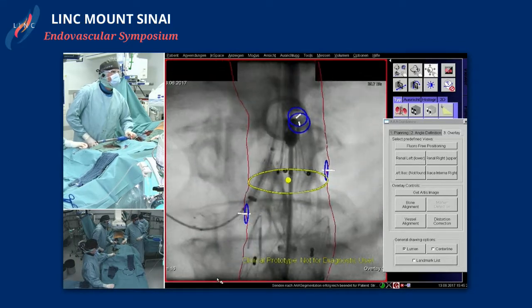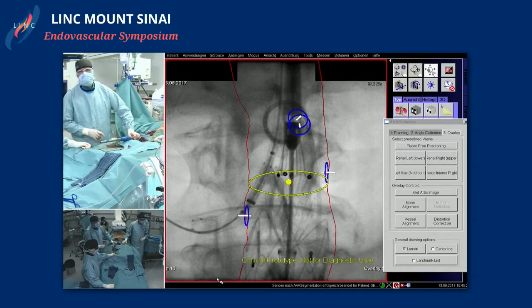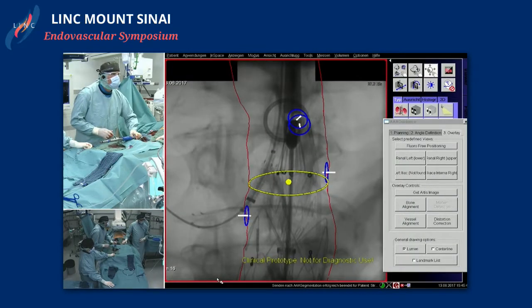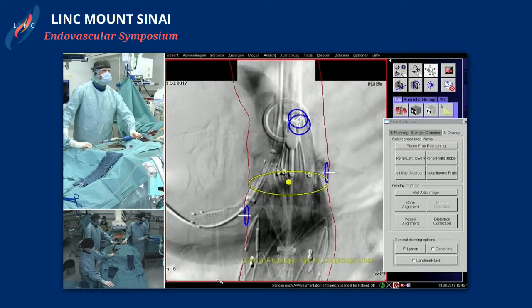And how long is your cuff? Another angio. 70, I think it's 70 millimeters long. Does anyone remember the distance of the Talent main body? I can't remember. They all, but this is an AUI, so. Something to really be aware of. So I am 2 millimeters too high, I think.